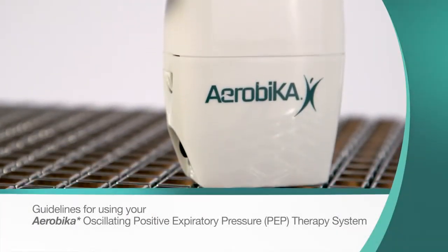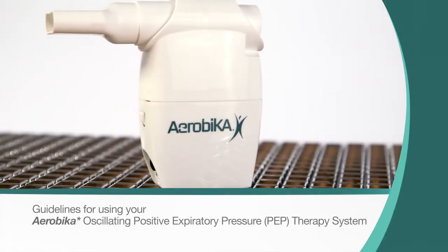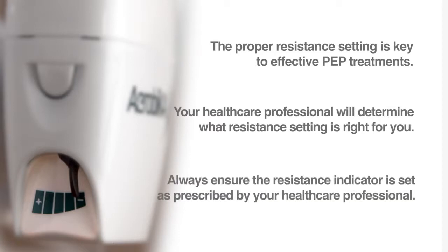Please follow these simple instructions when using the Aerobica Oscillating Positive Expiratory Pressure Therapy System, or Oscillating PEP device. The proper resistance setting is key to effective PEP treatments. Your health care professional will determine what resistance setting is right for you. Always ensure the resistance indicator is set as prescribed by your health care professional.